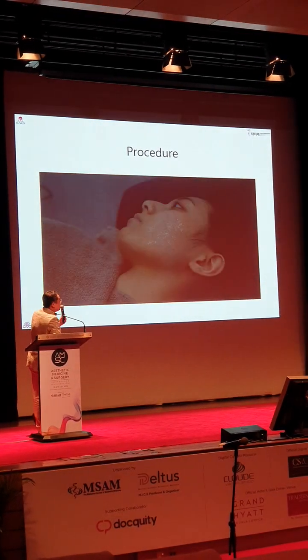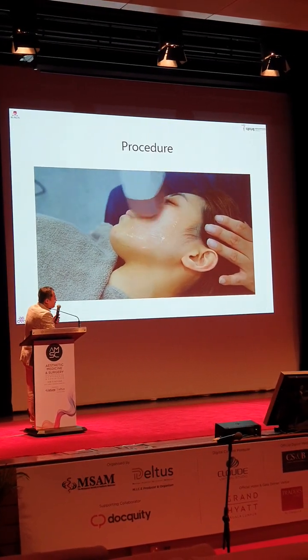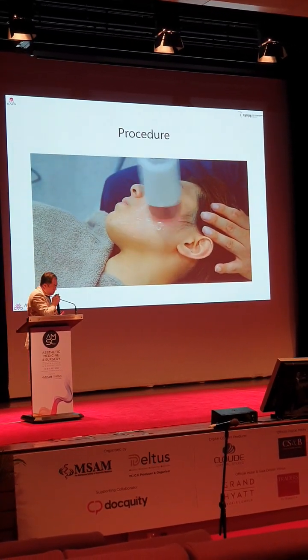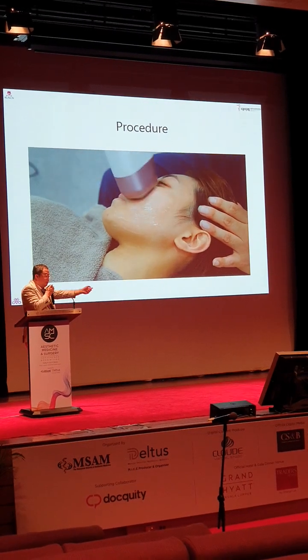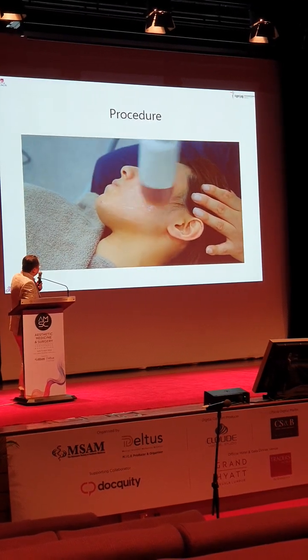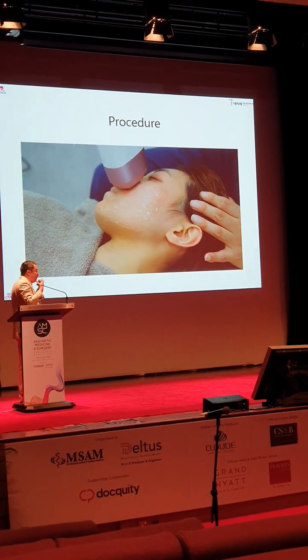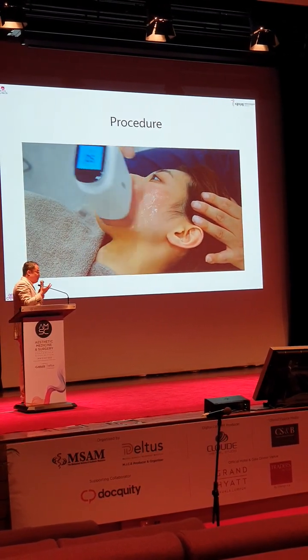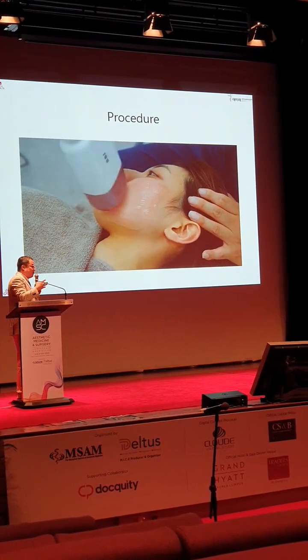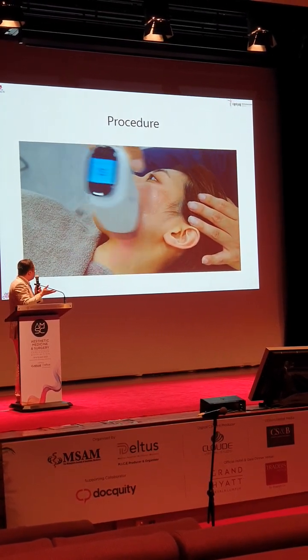First, I used a 50 millisecond pulse and 12 Joule for the first parameters, and also 5 Hz on this device. With those parameters, there will be no pain, but the patient might feel some warmth. So we have to tell the patient that if she feels very much pain or very high temperature, she has to tell me so that I could stop, or I have to check for skin burn.